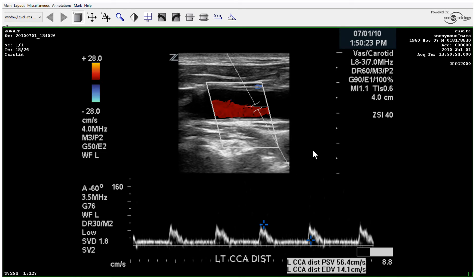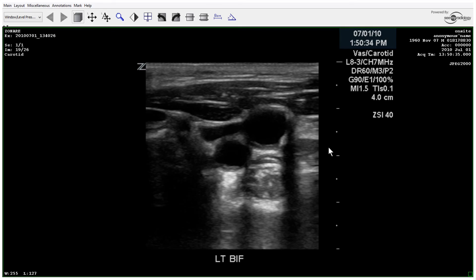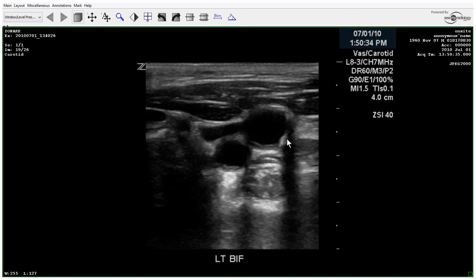Here's the bifurcation. You can see the ICA with some calcified plaque — we know it's calcified because of the shadowing happening posteriorly from these plaques right here. There's a little bit on the ECA as well, possibly coming from this area.